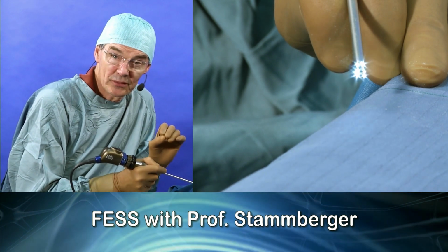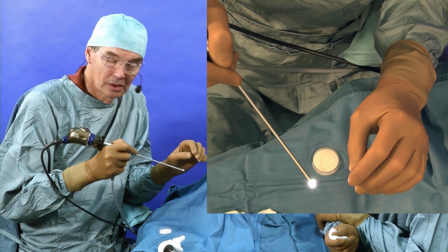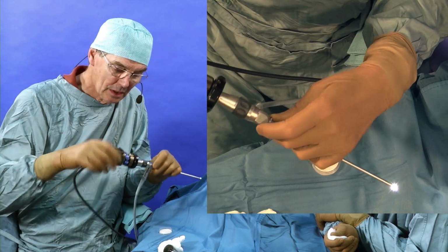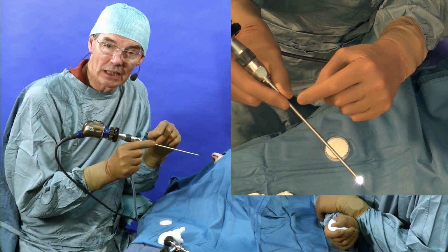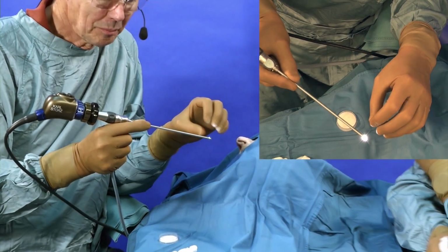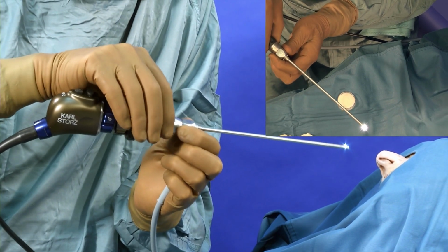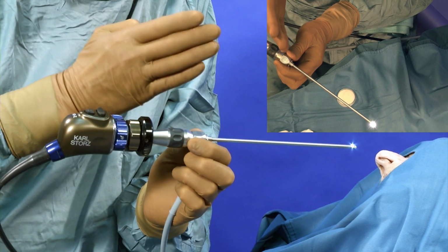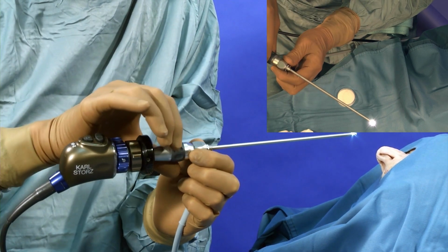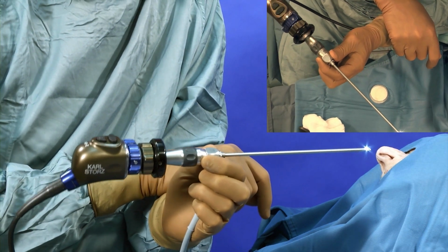Those little lights you have just seen shining are the eyes, or the front lights, I should say, of a new fascinating toy and development. This is the so-called Endocameleon of Karl Storz, where in one endoscope a mechanism is now built in where you can alternate the view from straightforward, almost 15 degrees, to 90 degrees up by means of an adjustable lens which sits right up there in the front.